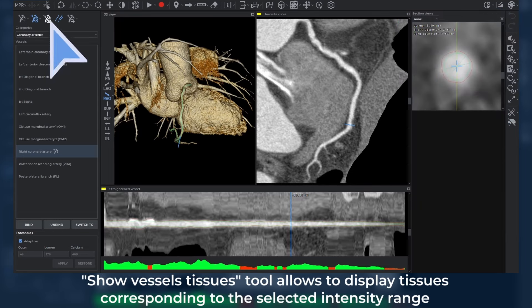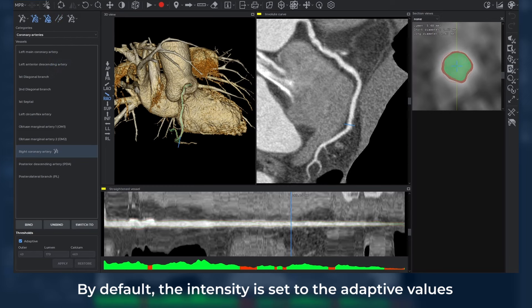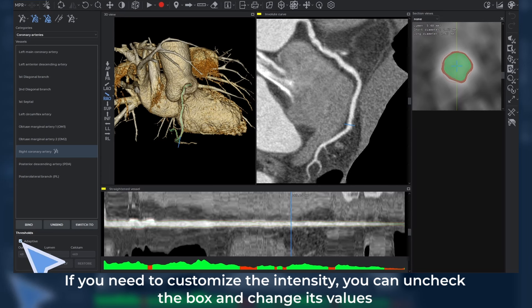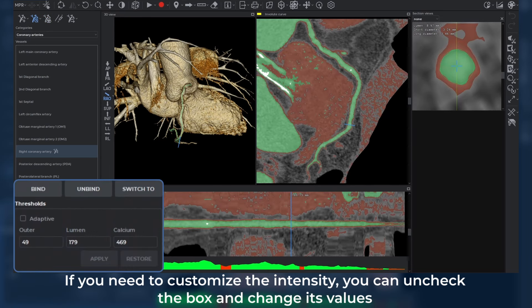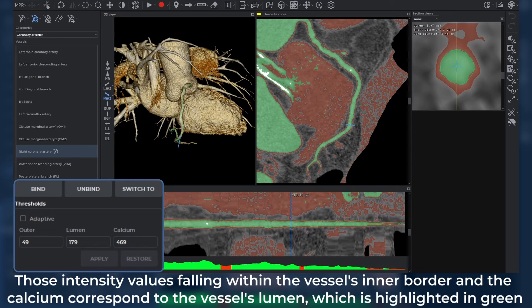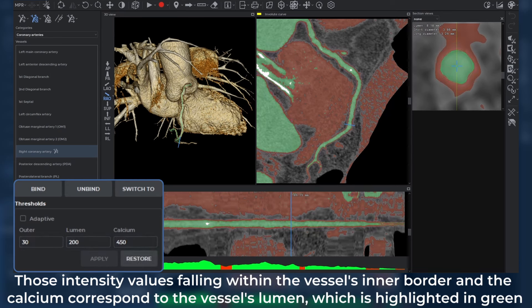The Show Vessels Tissues tool allows you to display tissues corresponding to the selected intensity range. By default, the intensity is set to adaptive values. If you need to customize the intensity, you can uncheck the box and change its values. Intensity values falling within the vessel's inner border and the calcium correspond to the vessel's lumen, which is highlighted in green.